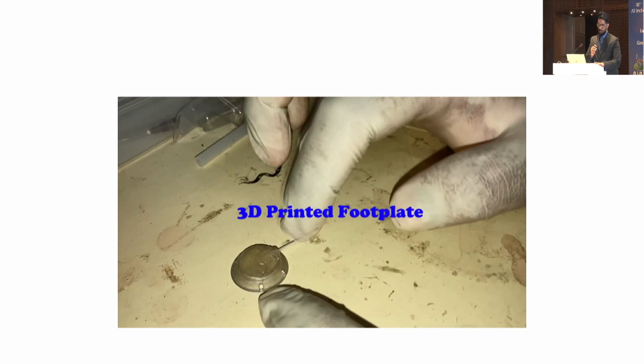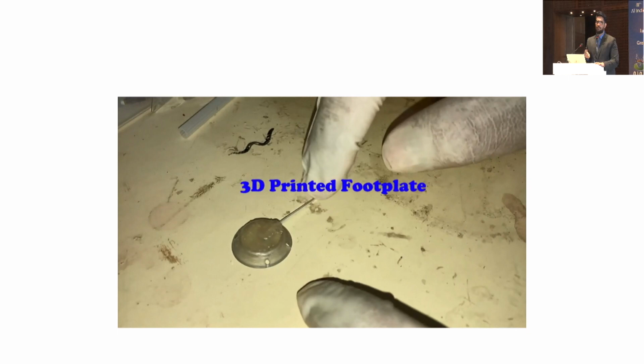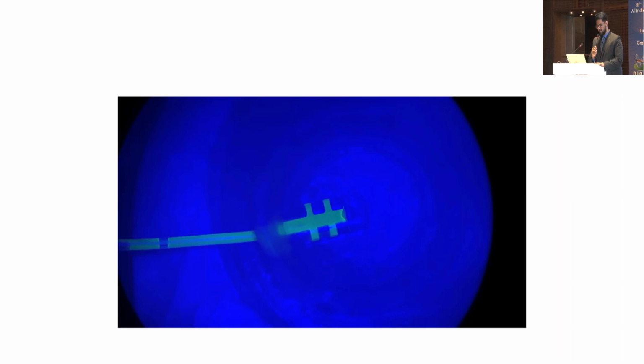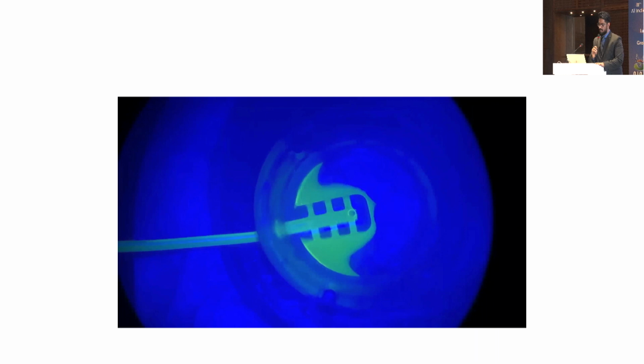Now we needed a tube to be part of the footplate. So we decided to use the pediatric Venflon, which is very similar in bore to the original device, attached it to the footplate, and got the actual footplate with the tubing in front. The tubing's patency is always checked to make sure there is no leak or block in any part of the tube. That is very important for the device to actually filter. So that's the first step, which is called priming.